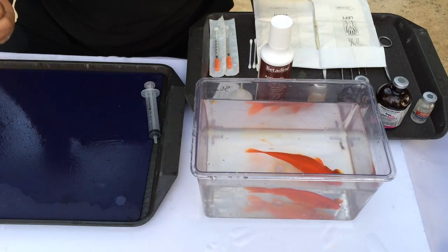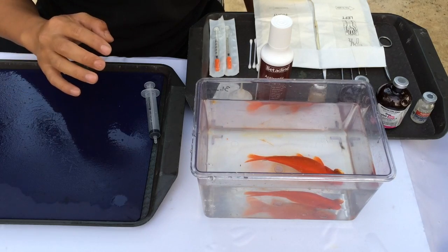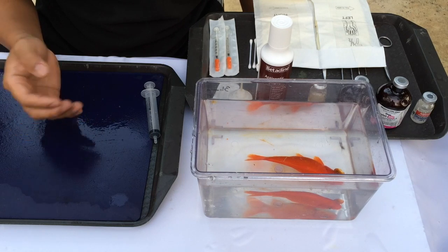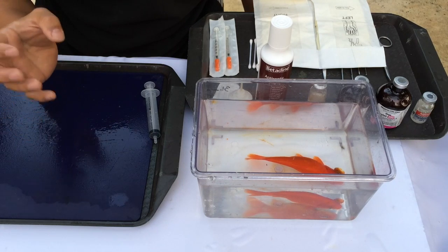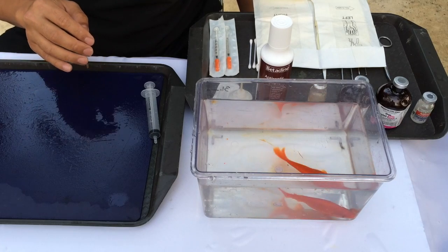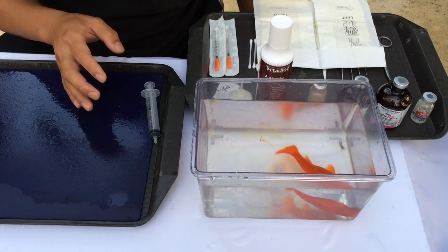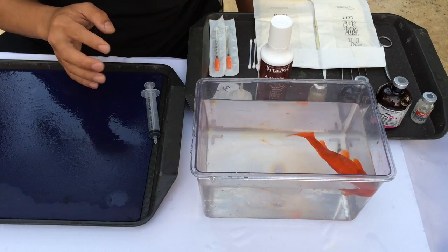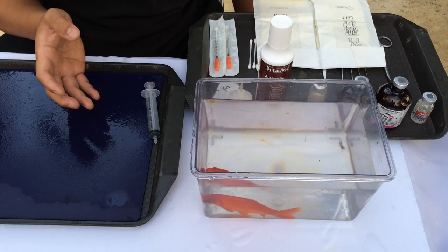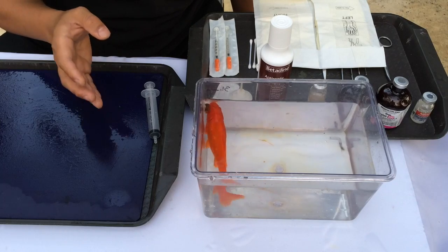We haven't used any aeration here because it's going to be a fairly quick procedure and the water is quite cool, so there's enough dissolved oxygen. But for longer procedures — anything from half an hour and longer — it's definitely necessary to aerate, or actually oxygenate the water. As he's being anaesthetized, he'll start losing balance and may go through an excitatory phase. You can see he's struggling because of his righting reflex — he's not used to not being able to control himself. That's quite a common reaction; every fish is different in how they react to the anaesthetic.